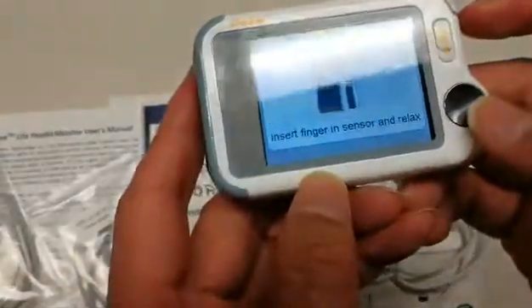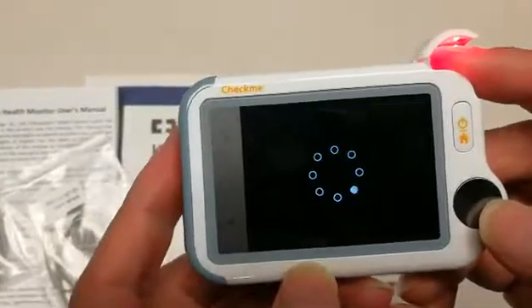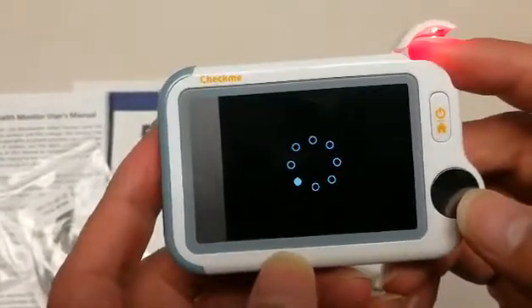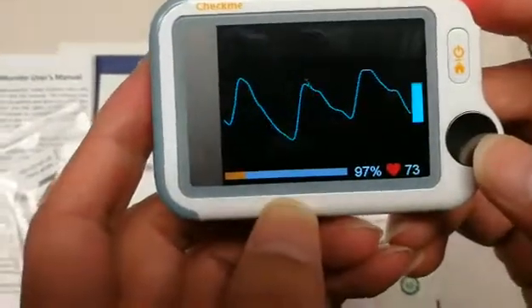Next will be the pulse oximeter option. Placing your finger inside the infrared tab will give you your SPO2 levels and your heart rate.